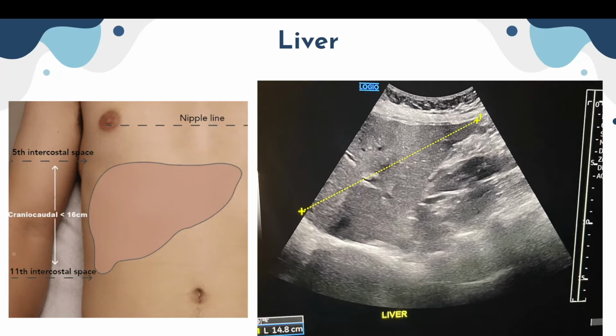Liver, the largest organ to scan in the right upper quadrant, cannot be missed. Wherever you put the probe, you will always see the liver. The protocol would be to scan it end to end, both lobes, sagittally and transversely, superior to inferior. I have a measurement of the liver up. Most places, the protocol is to measure the liver in the mid-clavicular line, deep inspiration, and where you see the portal bifurcation. Tip of the liver to the diaphragm, 14.8, a 15 centimeter liver.